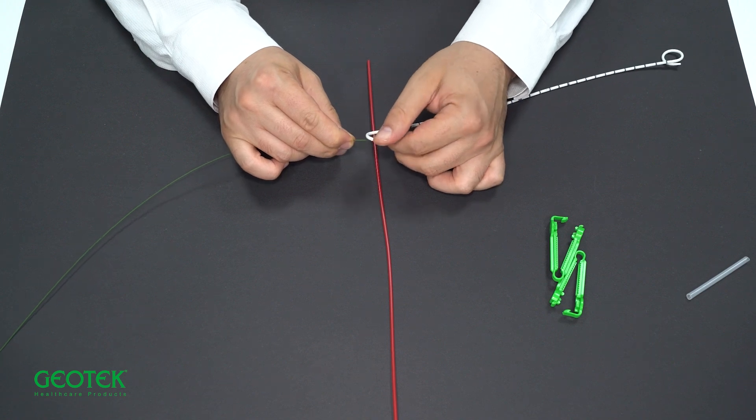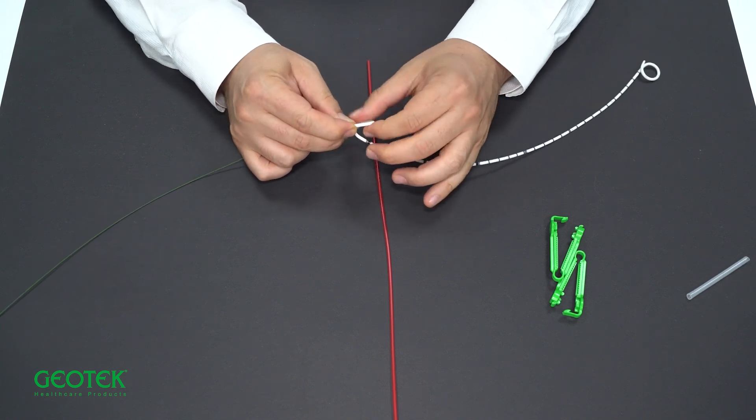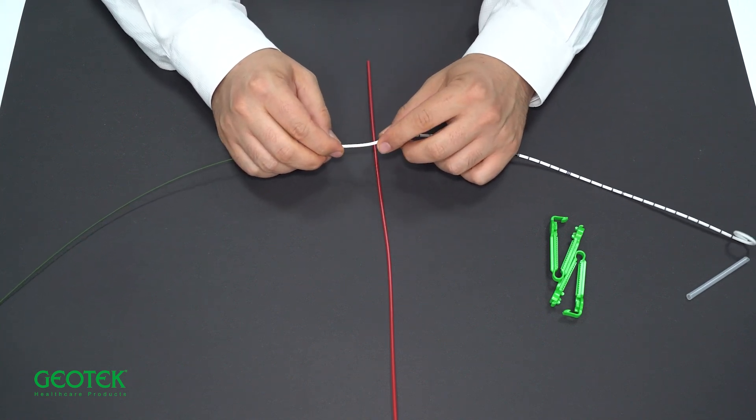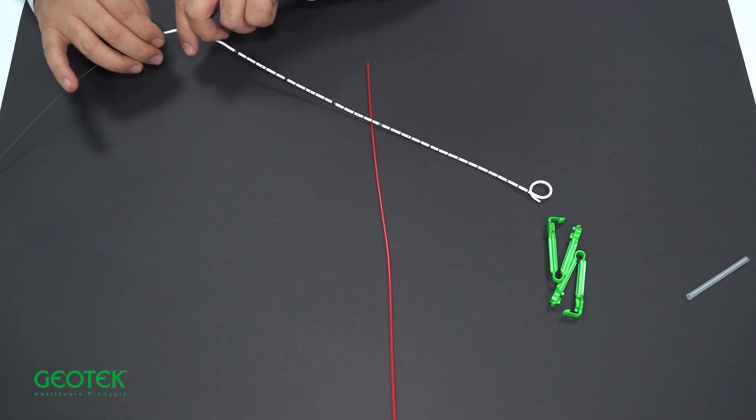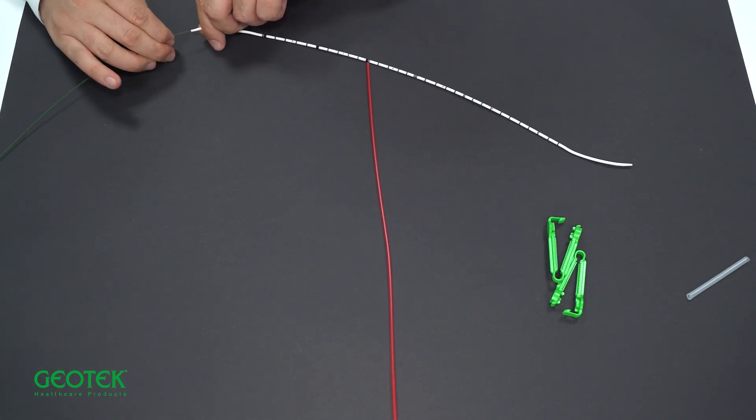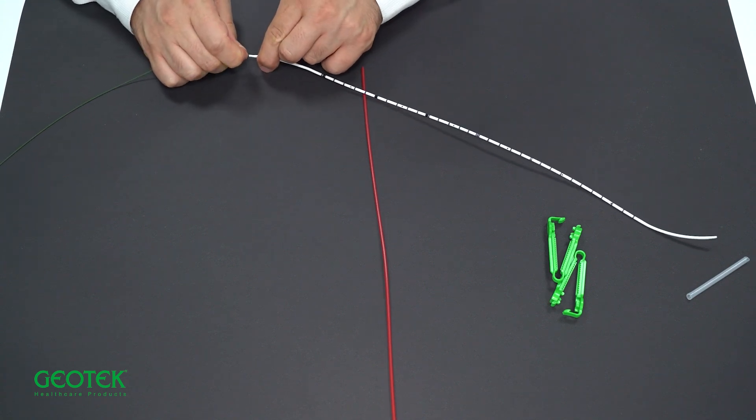Since these catheters are hydrophilic, it is sufficient to wet them with sterile saline. There is also no need to use an oily lubricant. When we run the guidewire through our double J stent, the tip of the stent will flatten.